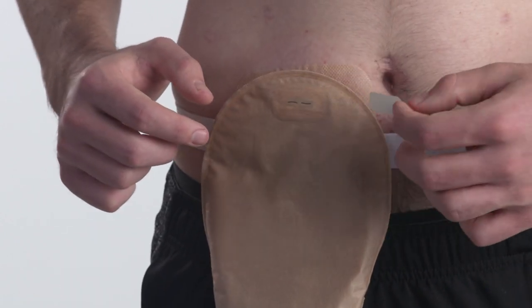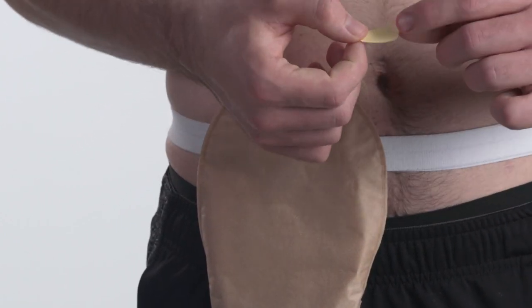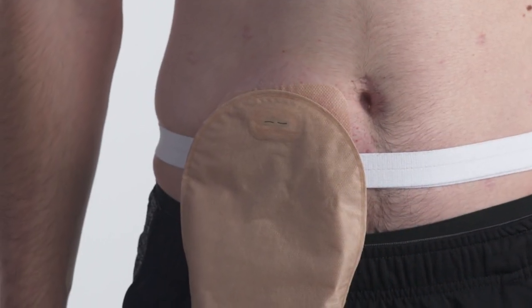Also, you may cover part of the filter with the filter cover to control the airflow from the filter. This will help keep some air in your pouch.